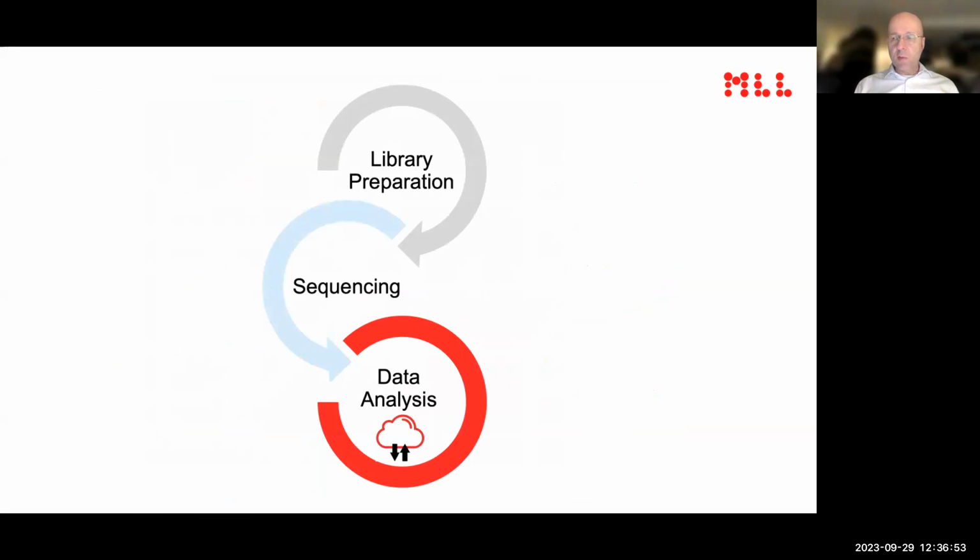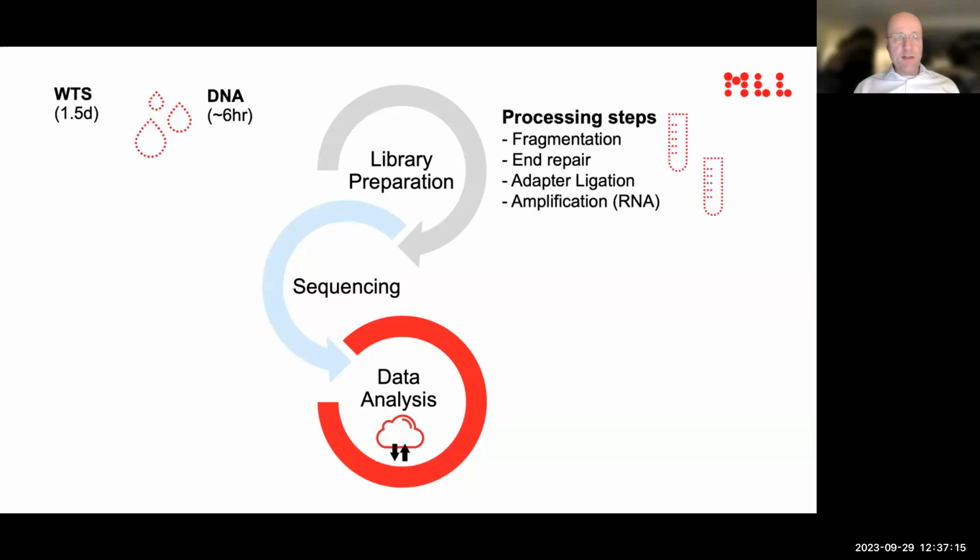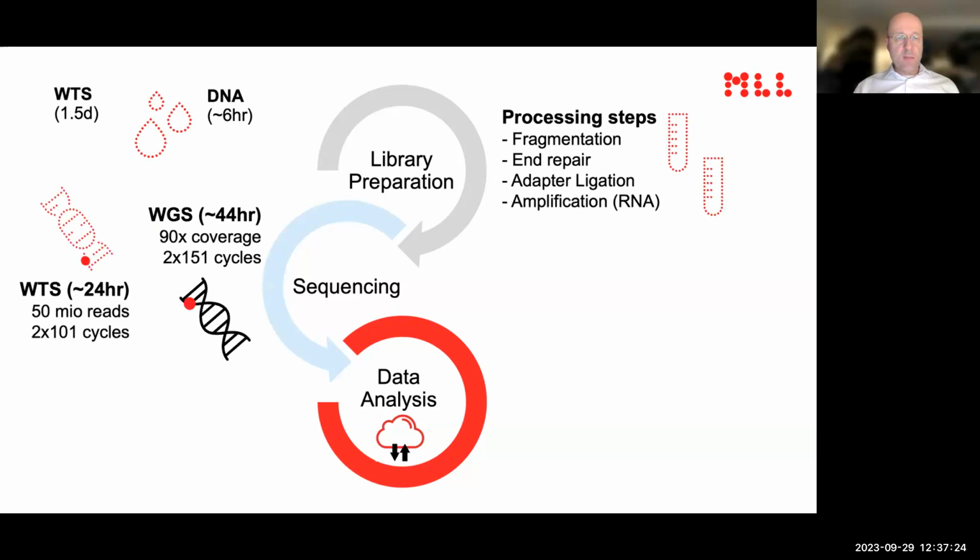Coming to molecular genetics, before we talk about application of AI and machine learning, I would like to focus on sequencing and whole genome sequencing. We have standardized workflows for library preparation, sequencing, and data analysis. And we can do whole transcriptome sequencing and whole genome sequencing.